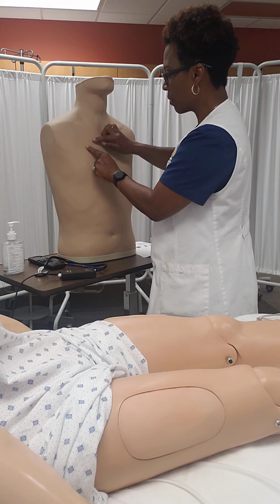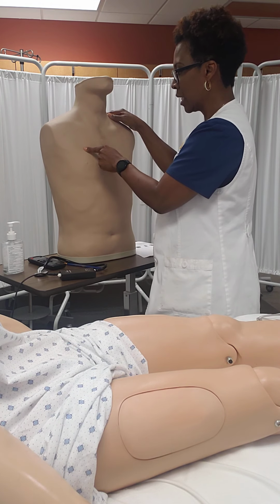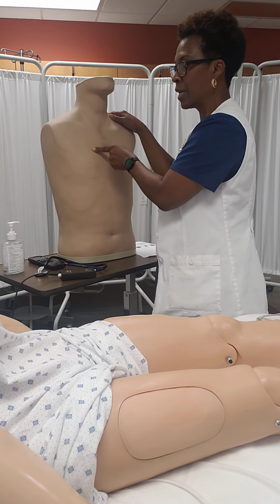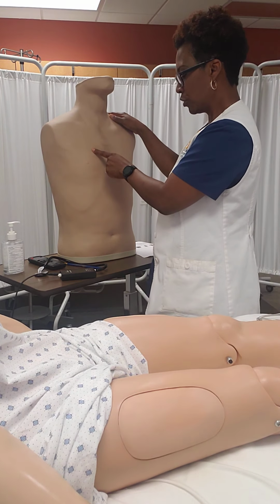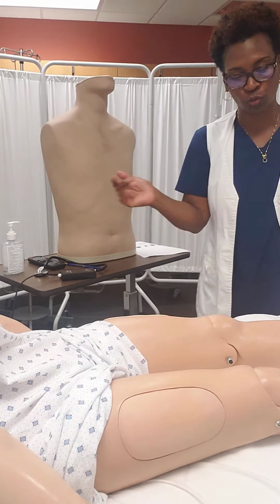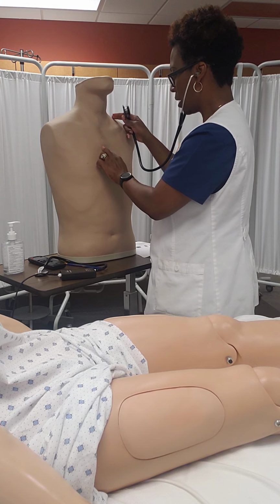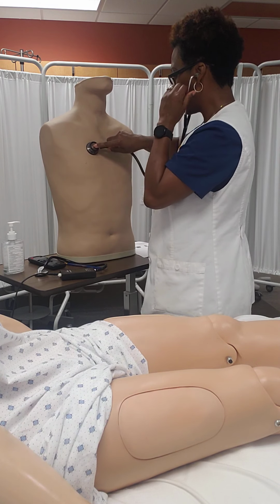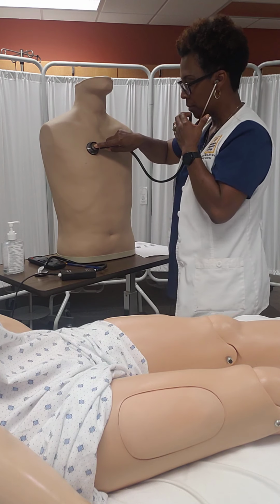You'll feel the second rib, and then you'll feel the intercostal space of the second. So the second intercostal space. That is where, if you were to sit your stethoscope, you should be able to hear the aortic. Okay? So you put your stethoscope there, and you should be able to hear it. We'll do this at the very end though. So I'll take this here, we'll feel here, one, and then here, and then that's your aortic, okay? So you should be able to hear the aortic there, okay?